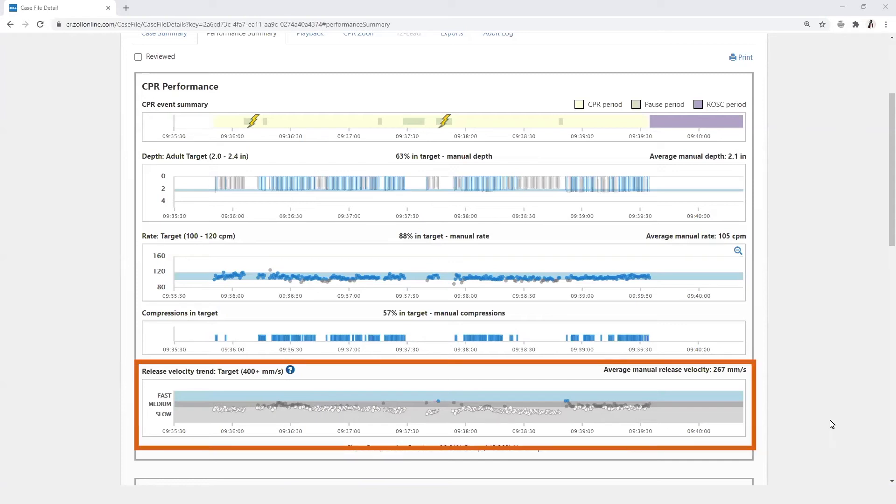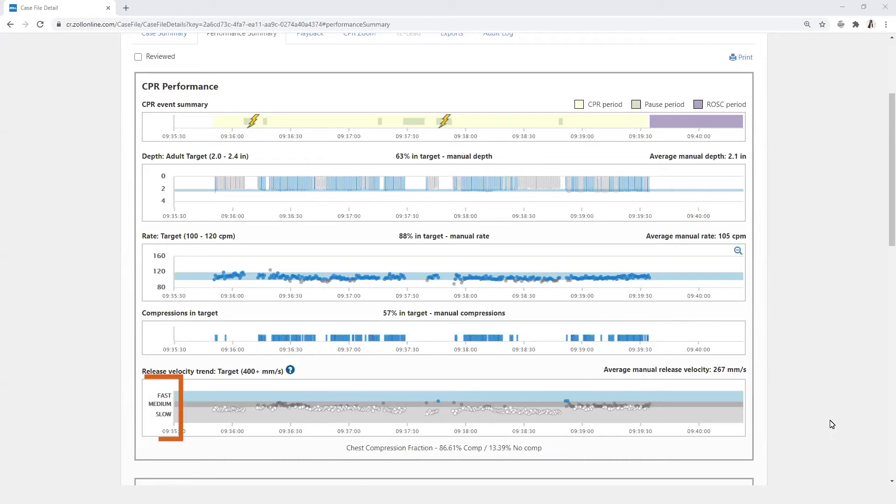Release velocity trend displays the chest compression release velocity of each compression. The vertical axis is specified as either fast, medium, or slow.